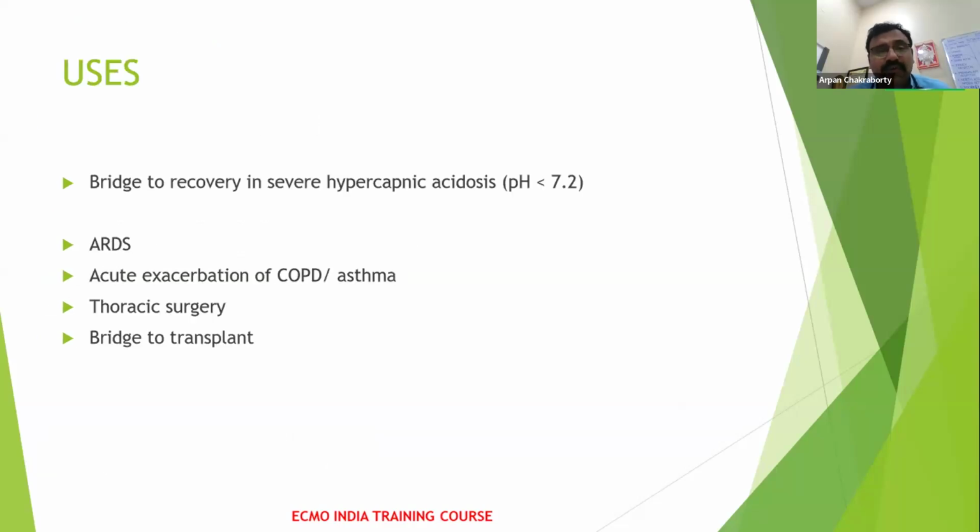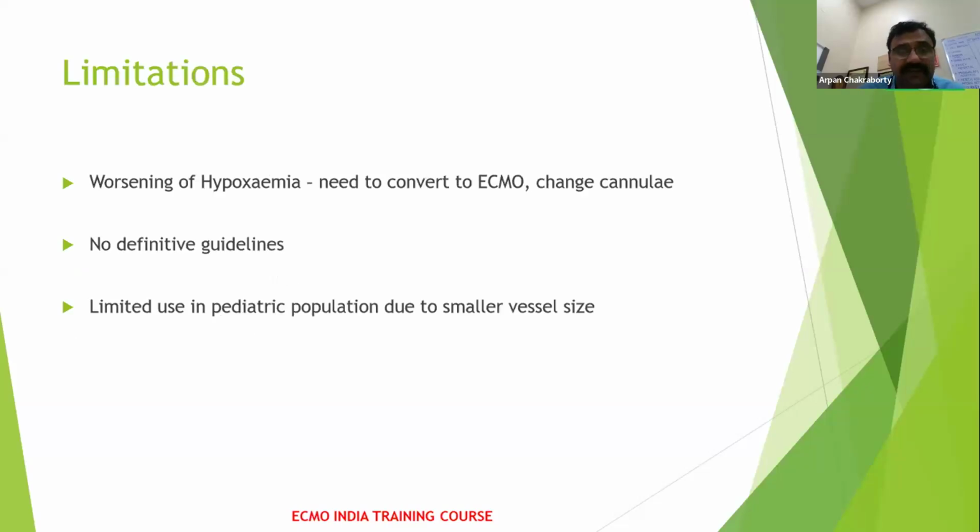Uses are mostly, as I told you, in two cohorts: in ARDS, to prevent lung injury with lung protective techniques, and in COPD, to prevent intubation when they are retaining carbon dioxide.